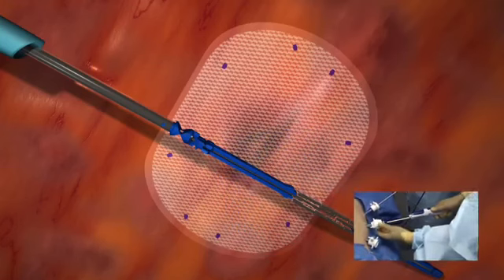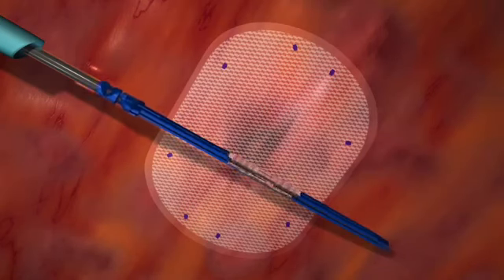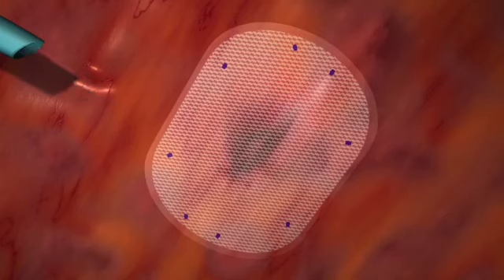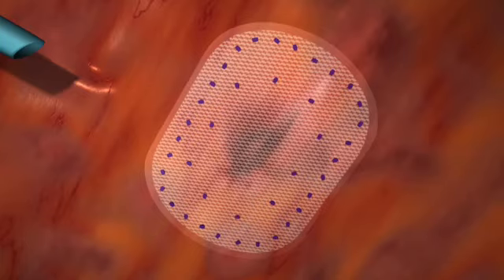Extract the device out of the abdominal cavity through the access port. Place the remaining tacks and then place the transfascial sutures using the EndoClose device.